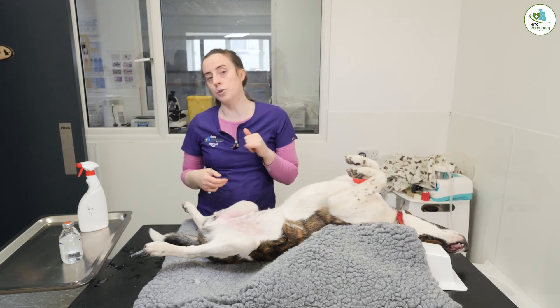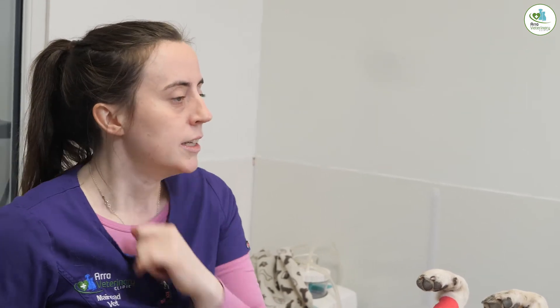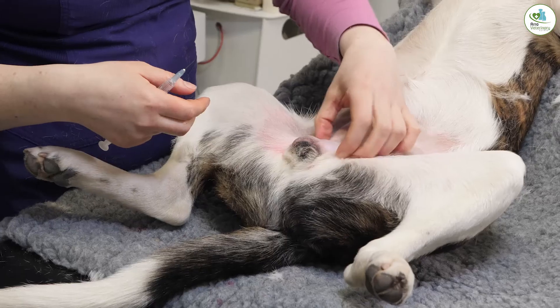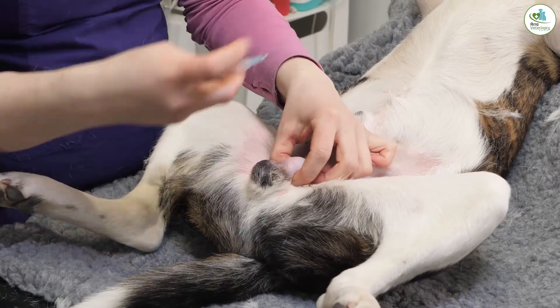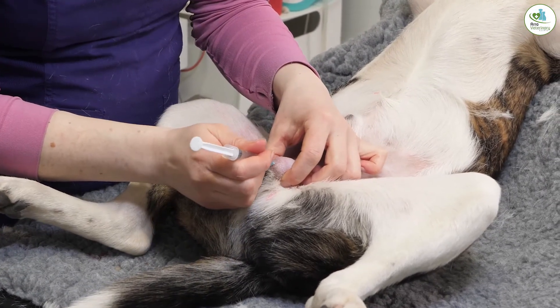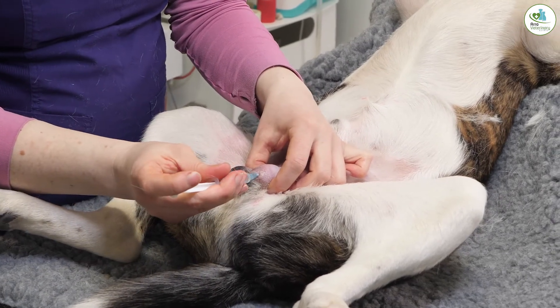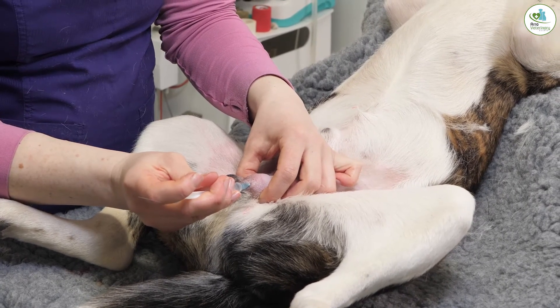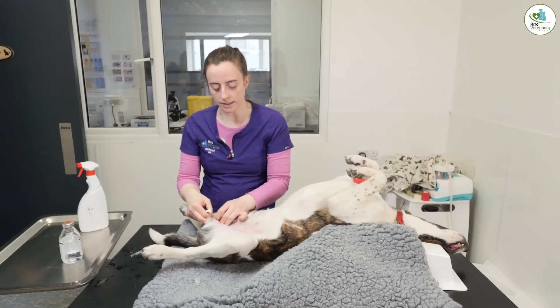In the testicles you can put in 0.08 mils per kilo of lidocaine. For Covey that's about a mil into each testicle. You hold the testicle, feel it in your hands, and go up in the direction of the epididymis. I have two mils drawn up, so we're just going to inject a mil — you'll actually feel the testicles swelling a little bit with the liquid. That's one side done, and this is the next side.